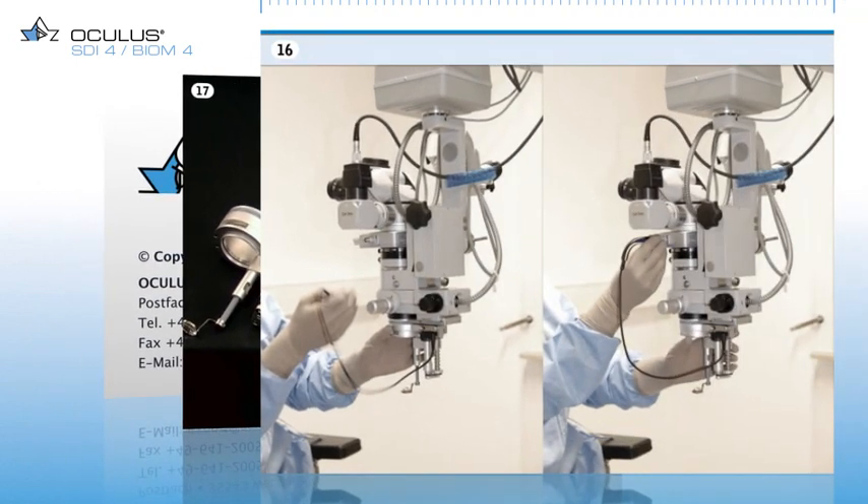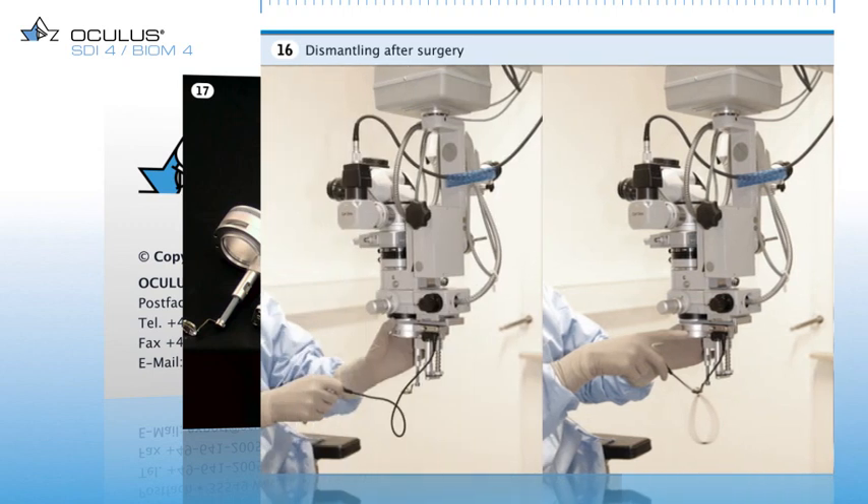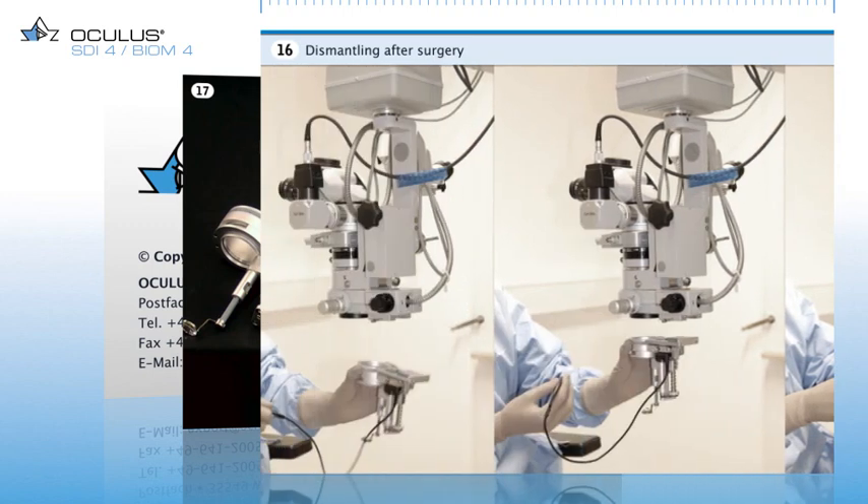After surgery, the Biome has to be dismounted and prepared for storage. Here you see the Biome 4C system being dismounted after an operation. Pulling on the cable sleeve unlocks the plug, which can then be easily disconnected. After releasing the knurled screw located on the side, the Biome 4C system is completely removed from the dovetail mount.